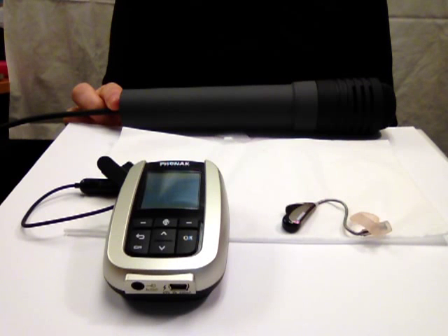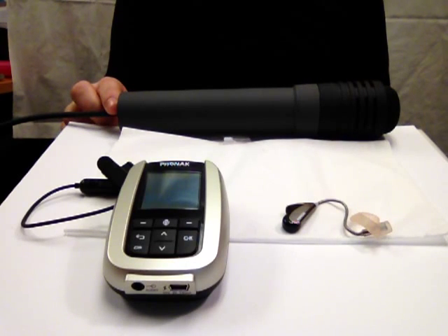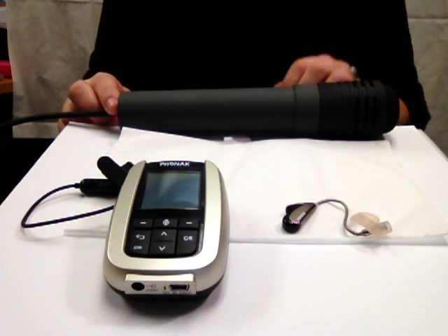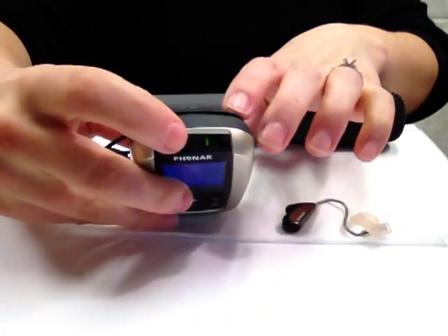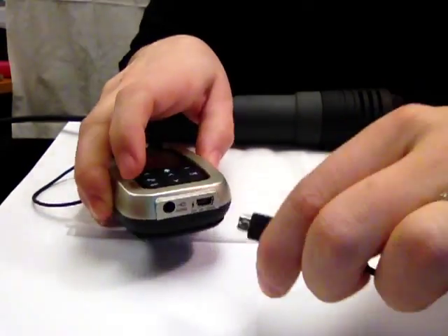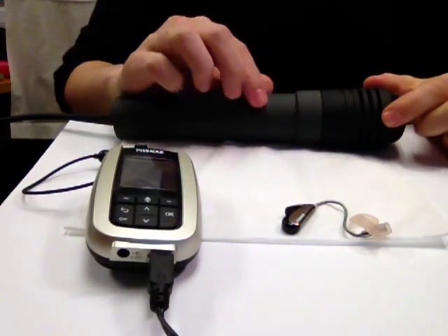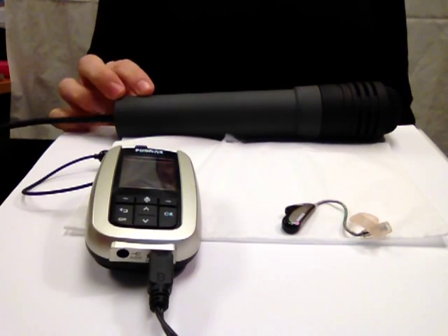When the equipment is not being used, it should be taken to the classroom and put into the case provided. The following steps should be used. Turn off the Inspiro transmitter and plug the charging cord into the Inspiro. And then, of course, the other end will go into a wall outlet. The Inspiro must be off to charge properly.